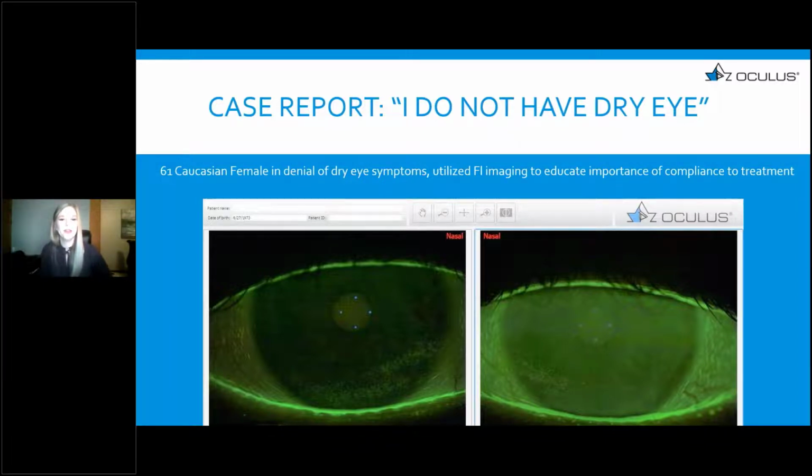She said, okay, let's take a picture, and she showed her and said, look at all these here, those are like micro cracks in your hand. That's the way that I describe SPK. I say if your skin is super dry, you get micro cracks in your skin, because I'm up in Michigan and it gets really cold in the winter, if you didn't know, and people get really dry skin. So they get that analogy.